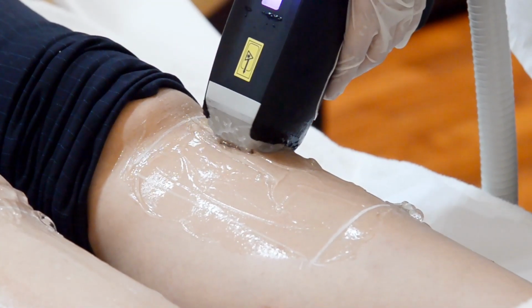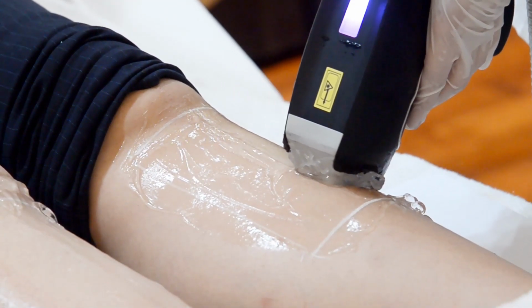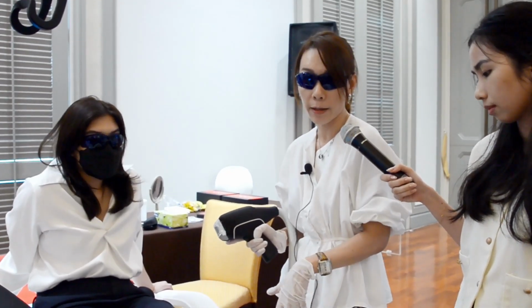You can hear it go beep, beep, the 2 beep sound, and then you glide across the treatment area. How do you feel? Is it okay? It's okay. So that is you delivering 2 frequency, 2 hertz.